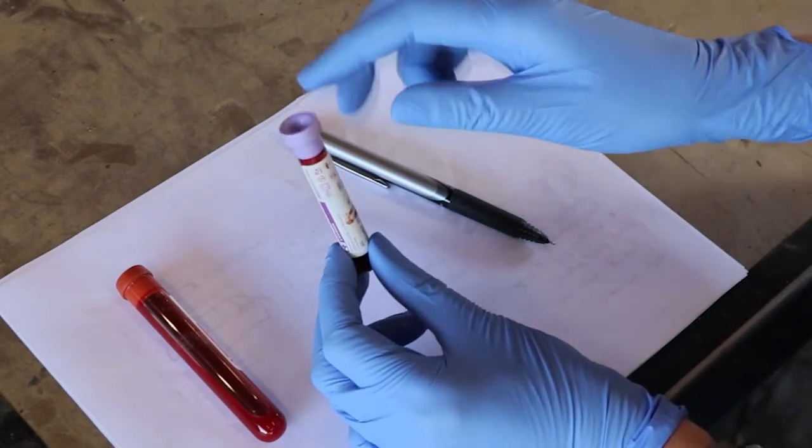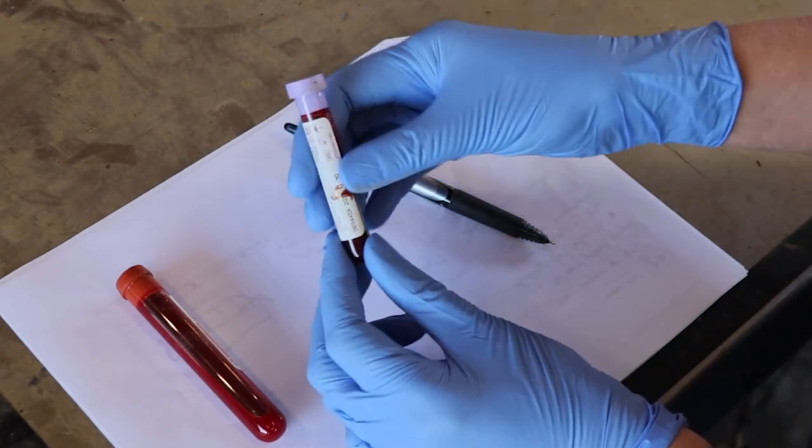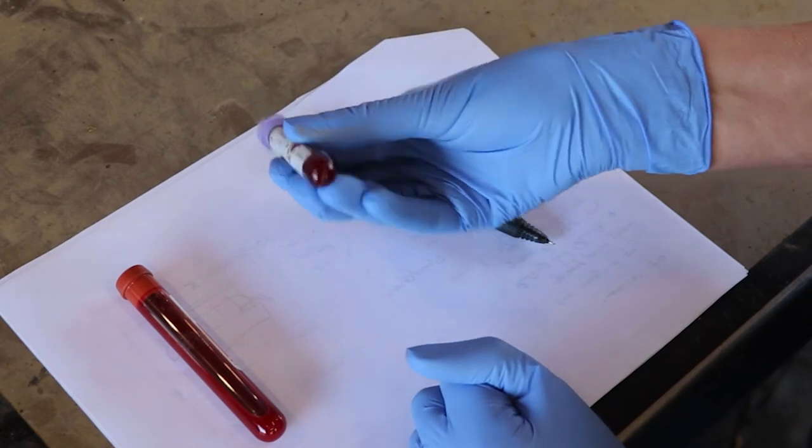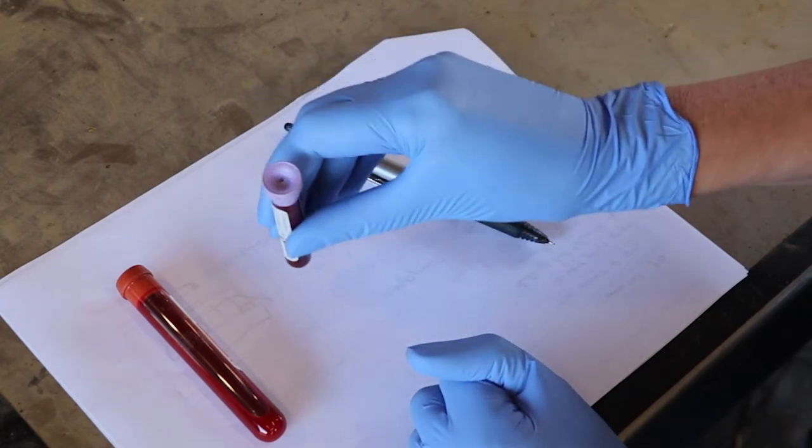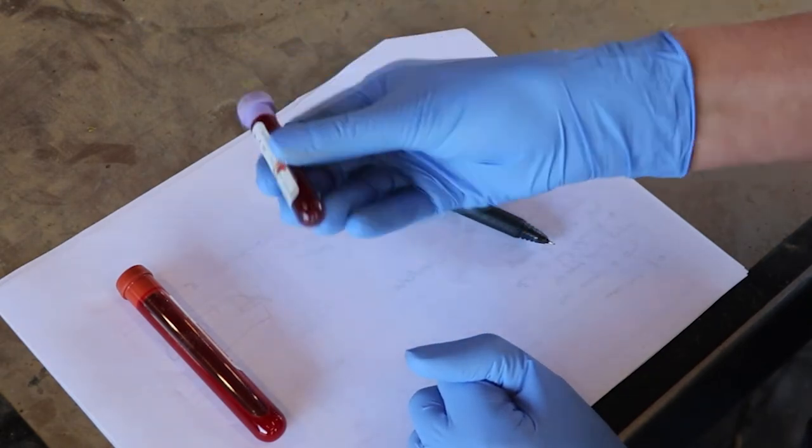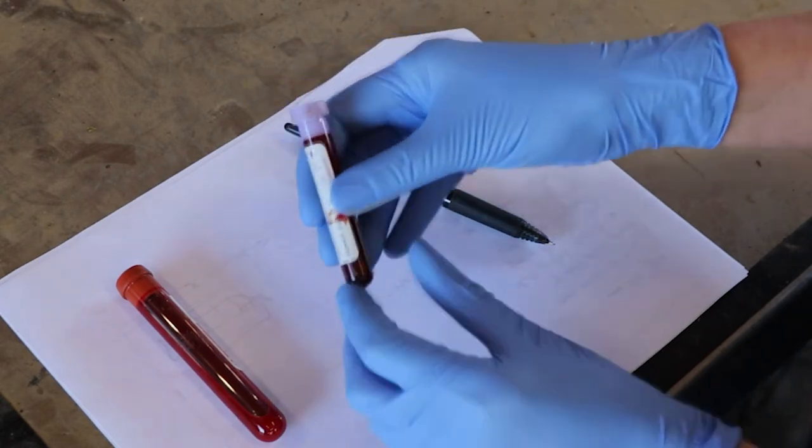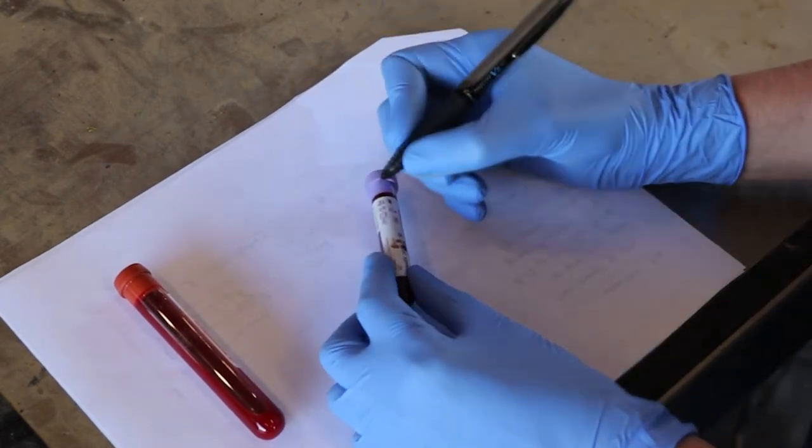If the tube contains an anticoagulant, basically any color other than red, you need to distribute the anticoagulant by gently rocking the tube several times. If you forget this step, the blood may clot and may not be usable for the intended purpose.